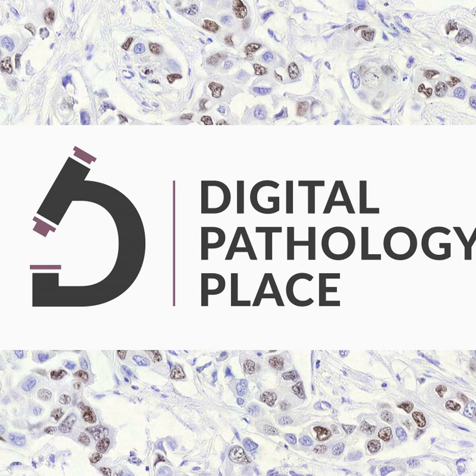C. Companion diagnostic development. Digital pathology is instrumental in the development of companion diagnostics, which are laboratory or diagnostic tests used to determine the suitability of a particular drug for a specific patient. These diagnostics are essential for the concept of personalized medicine, where treatments are tailored to the individual patient based on their unique genetic and molecular profile.